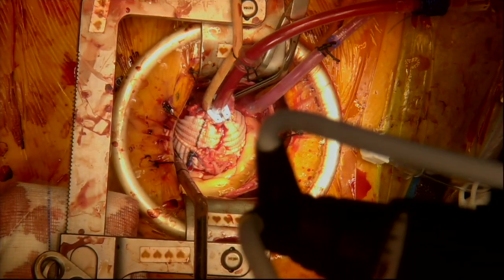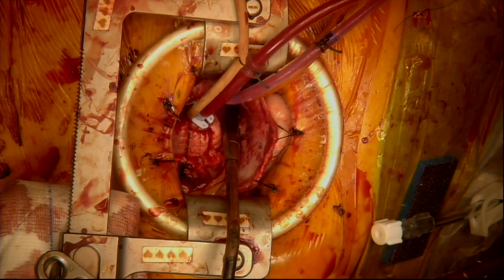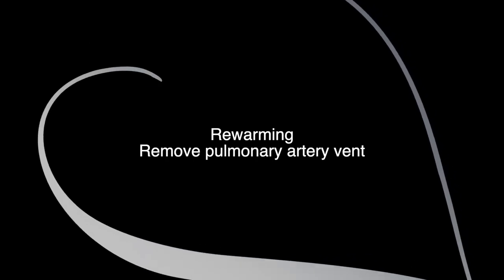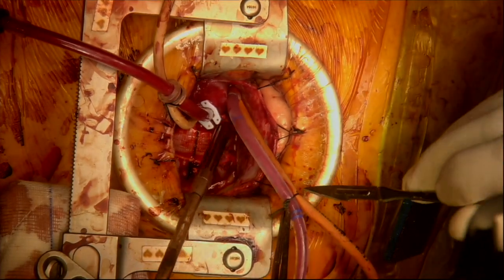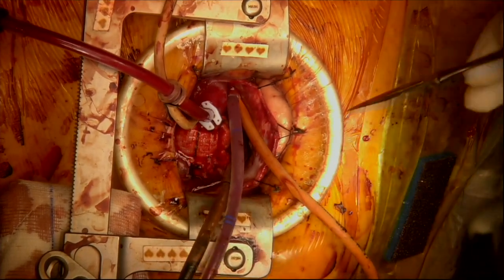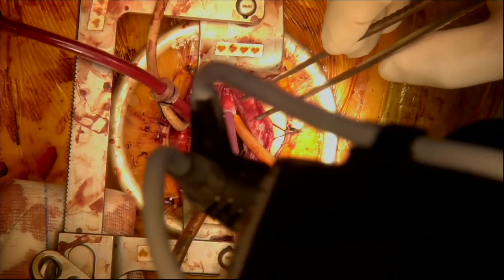The cross clamp is released and now de-airing and re-warming can commence. The vent cannula in the pulmonary trunk can now be removed. Maintaining gentle pressure on the snare, the cannula is withdrawn.